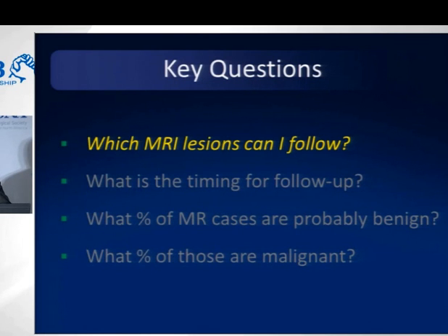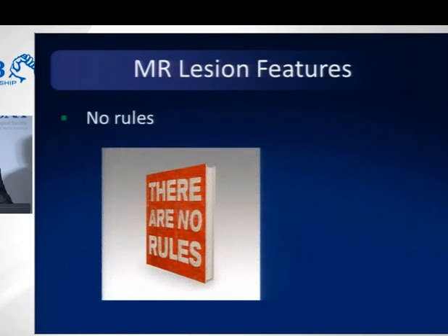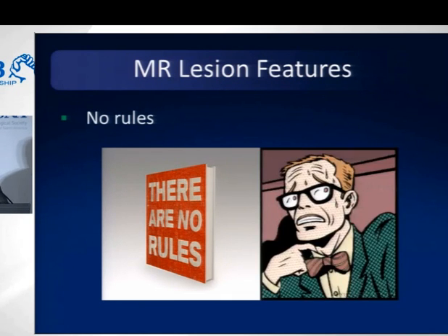Starting with which MRI lesions can I follow? And I hate to tell you this, but when it comes to MRI, there are no rules when it comes to what lesions are safe to call probably benign. That's the take-home message when it comes to MRI. And I got to tell you, that makes us nervous.